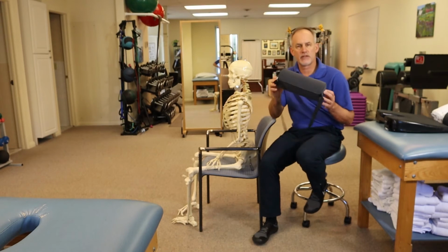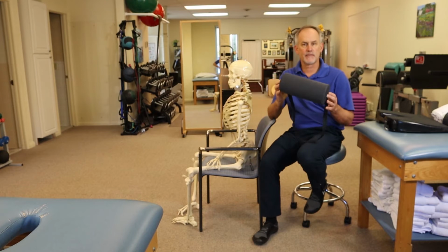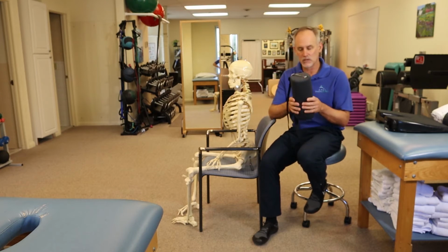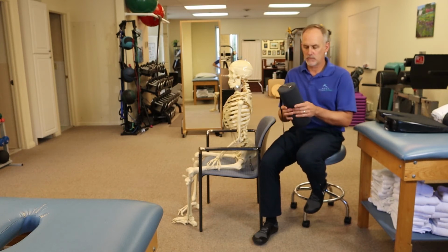So this is a standard, they call it the original McKenzie roll, lumbar roll. This is one that I recommend in the clinic. It's got a little bit of give to it. You don't want a lumbar roll that's too firm. It'll kind of irritate someone's lower back, especially if they're having a lot of spasm and such. It should compress a little bit.